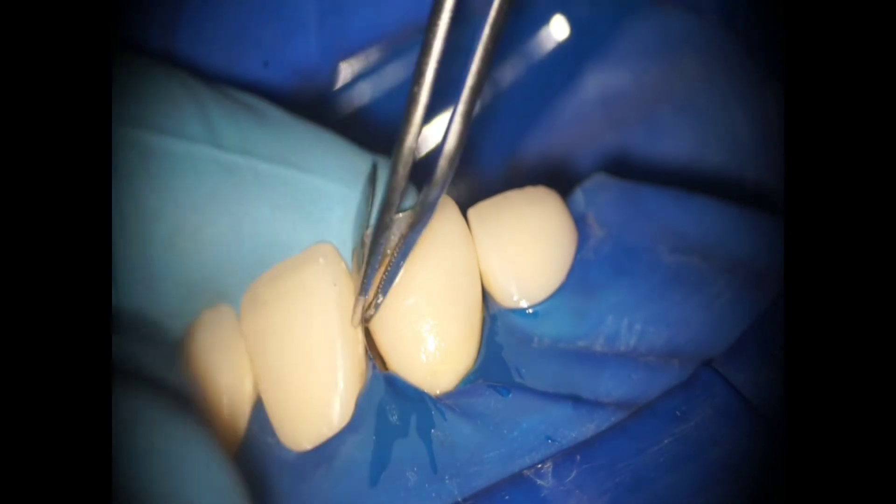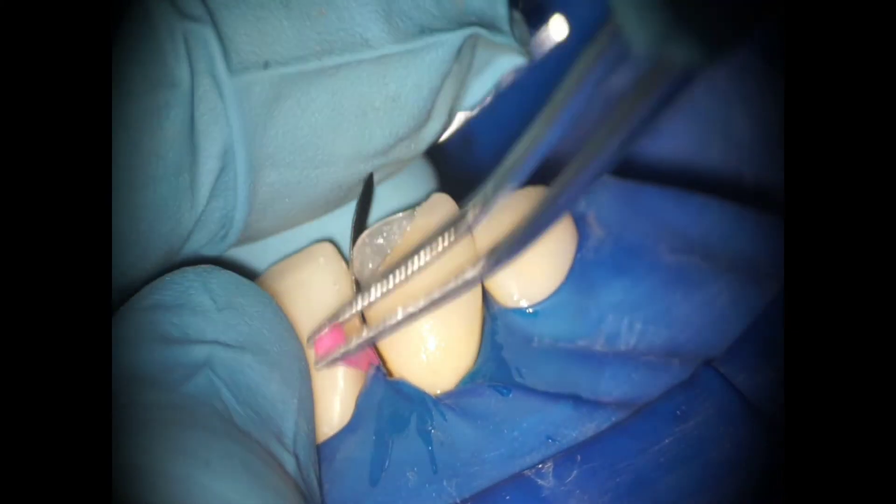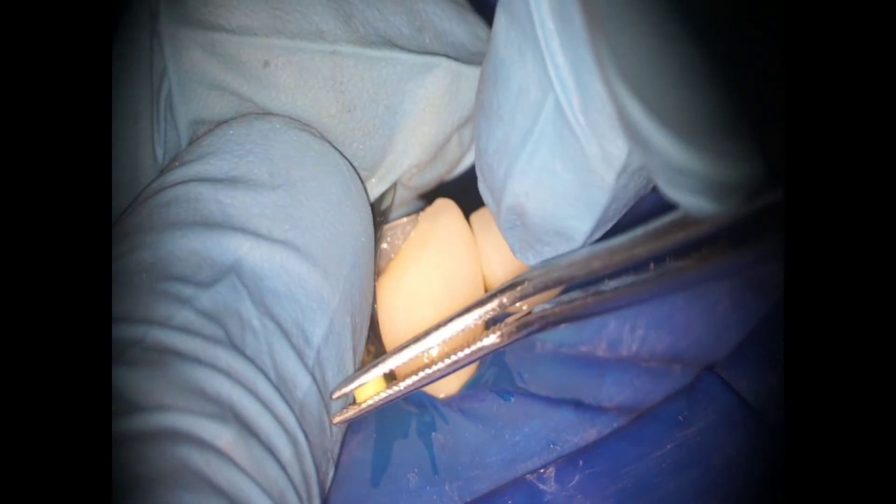Now to make the mesial wall, apply the sectional matrix — posterior sectional matrix. Stabilize it with the wedge. If the wedge is loose, take the wider wedge. This metal strip should not move.